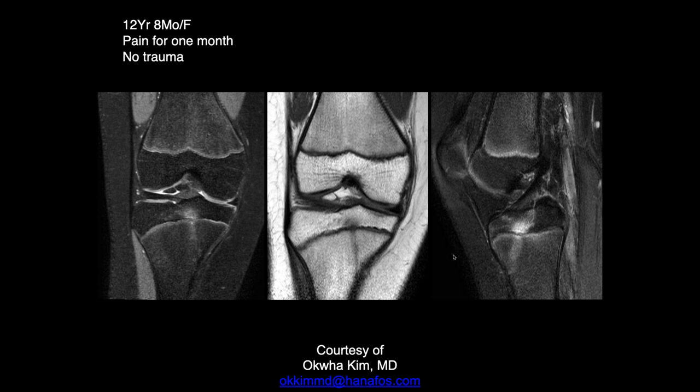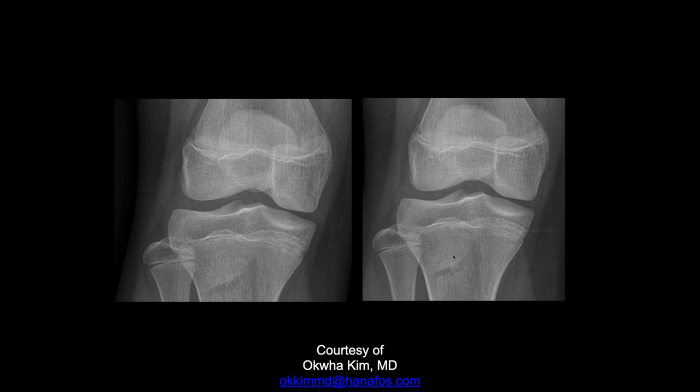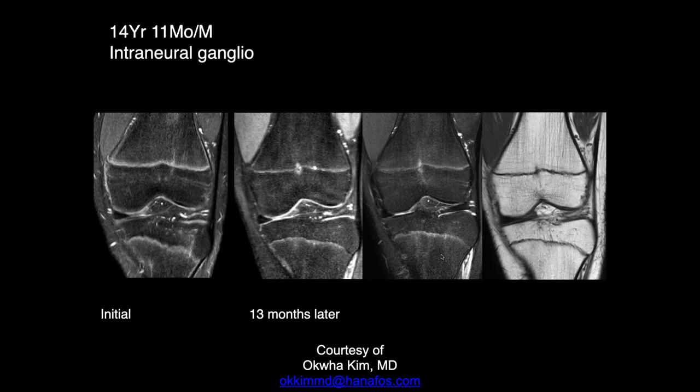What's happening with that physis? There's some edema around the physis and it looks like it's a little wider than the remaining physis. I'm thinking some kind of stress reaction. So, and then 13 months later, it looks like most of that edema has resolved.